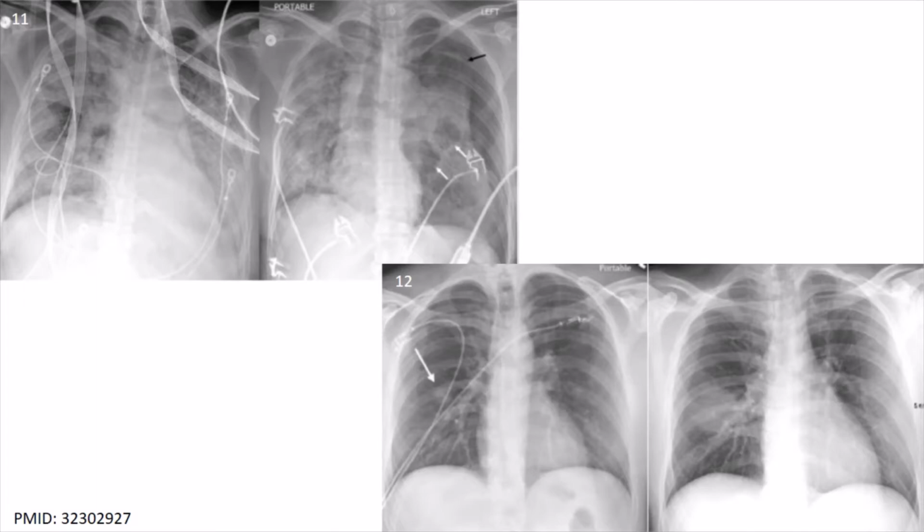As the pandemic progresses, the medical community will frequently rely on portable chest X-ray due to its widespread availability and reduced infection control issues that currently limit CT utilization. The following video describes basics of ultrasonography.